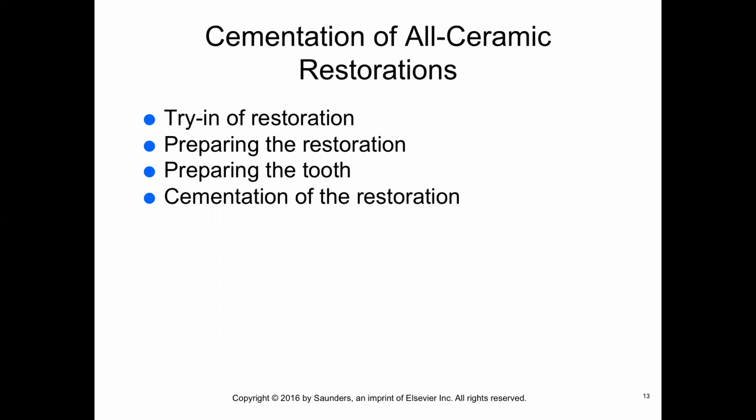After etching the internal surface, the surface must be treated. Non-glass ceramics do not etch well with hydrofluoric acid. They can be sandblasted internally to provide a roughened surface. All of the glass-based ceramic materials should be bonded to the teeth with resin cement. Etching can be done to facilitate bonding to the tooth structure. Bonding them to a rigid substrate greatly enhances their resistance to fracture.